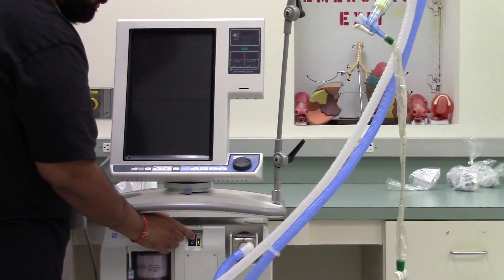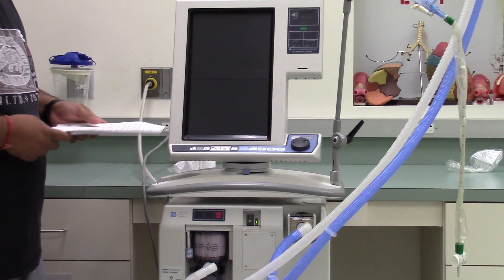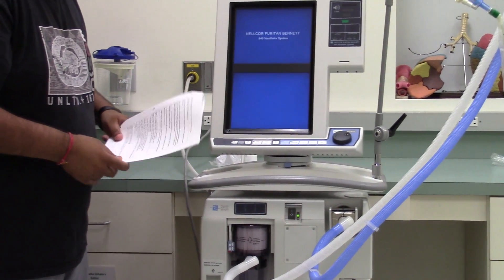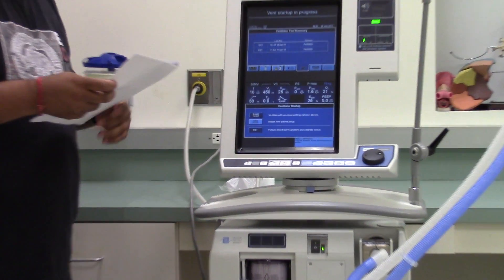This is our power switch — turn it on. The ventilator is ready to start, and we'll get the screen up.